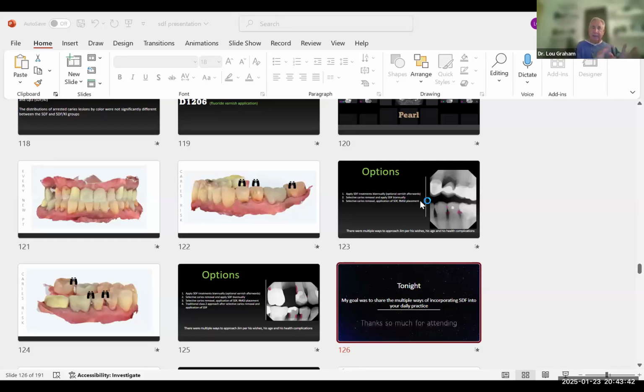When I'm air drying my bonding agent, you want an air-only syringe, not an air-water. I know you squirt the water out of the air, but there's still water droplets. The water creates a hydrophilic moment, and all of a sudden your hydrophobic bonding agent isn't so hydrophobic, it starts leaking. If you're doing everything right and you're placing your composite and you're having sensitivity, it's probably honestly a little bit of what's happening before you're placing your composite, the way you're etching and bonding.